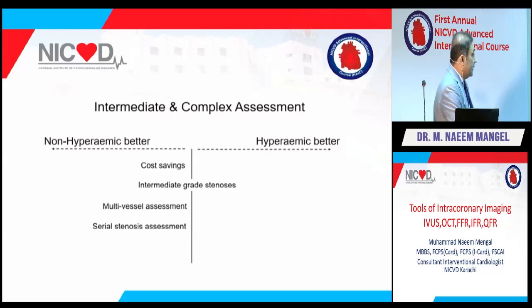Then in the same way, for cost saving, and when you have to use it again and again, these are the patients in whom you can use iFR in a better way.